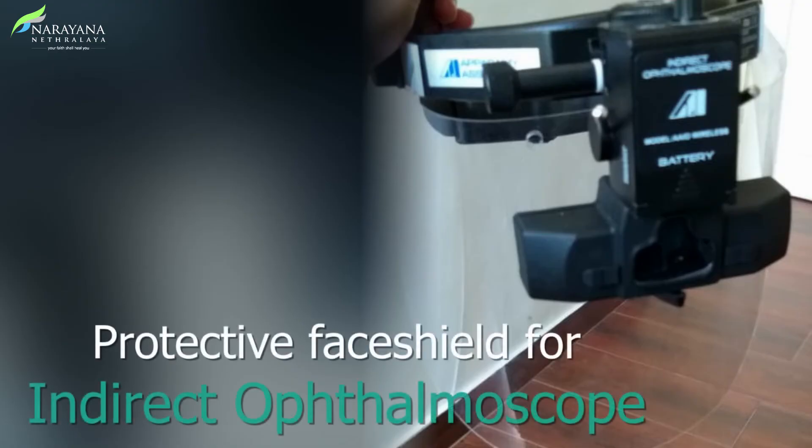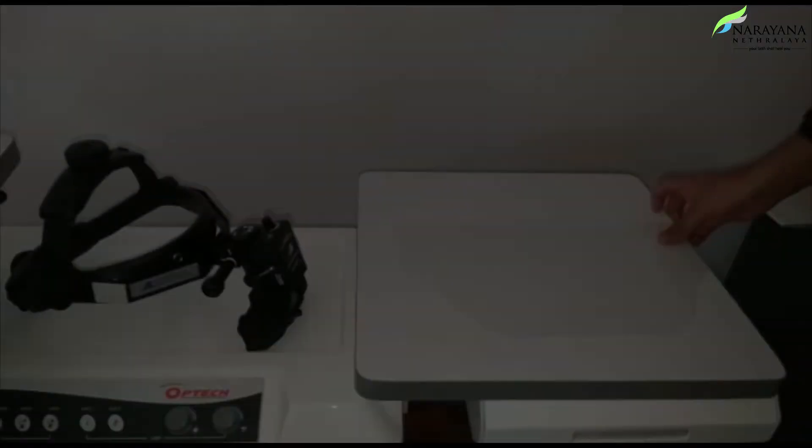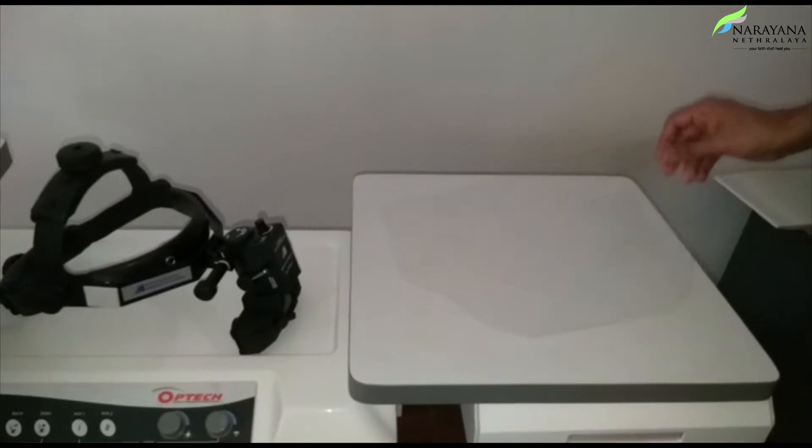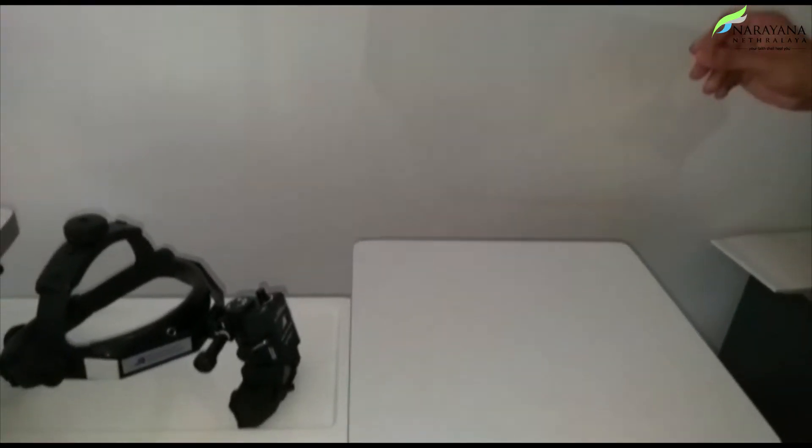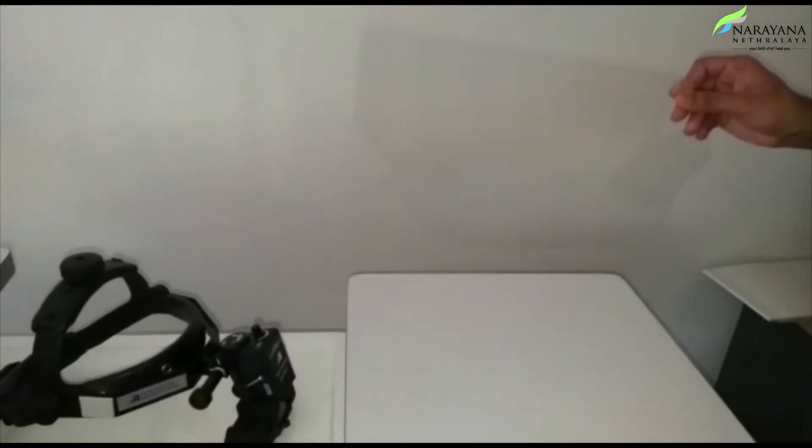Here's a short video to demonstrate how a face shield can be made for IDO examination. Materials required include a transparent sheet like an OHP sheet or file sheet and double-sided adhesive foam.